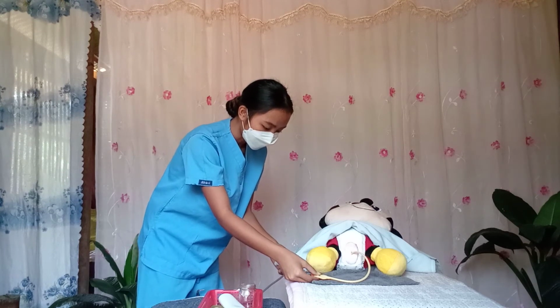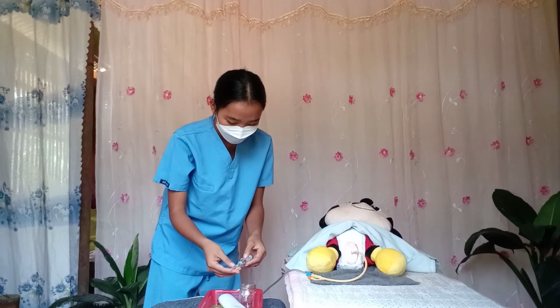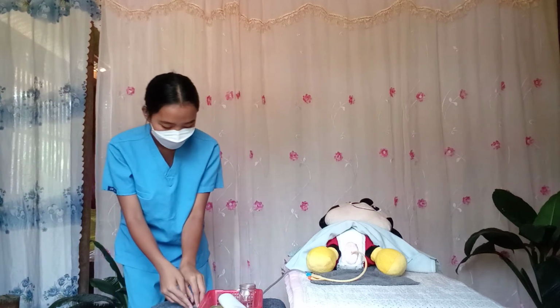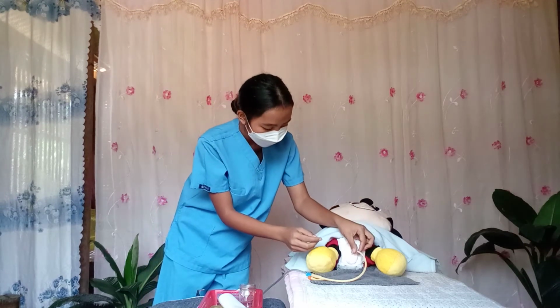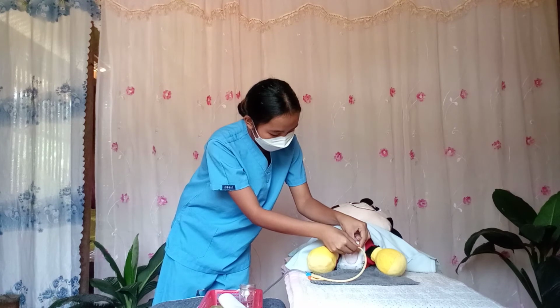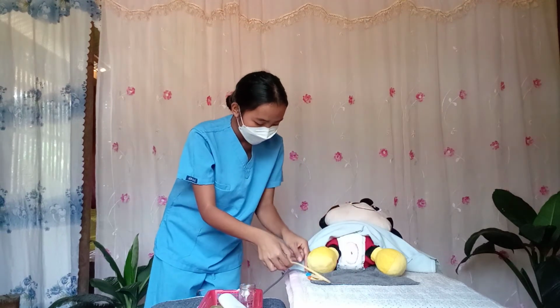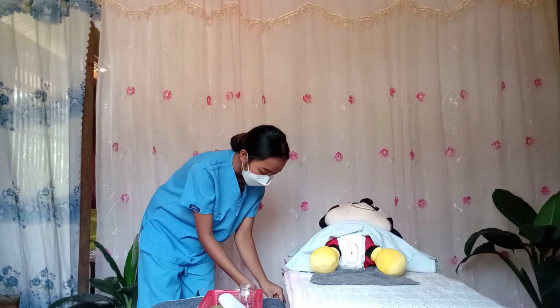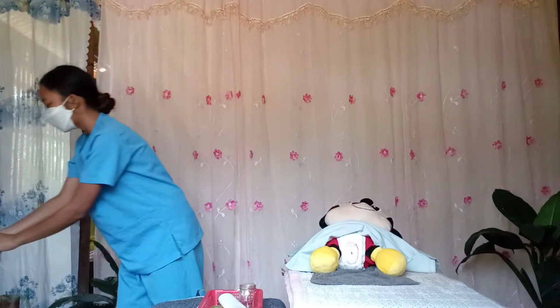And then easily pull the catheter. So dispose of it together with the urinary bag. Dispose of it properly.